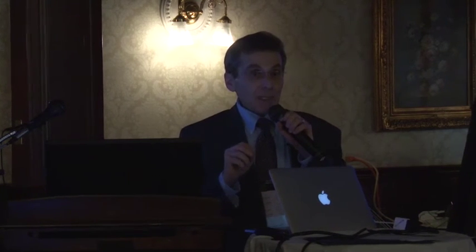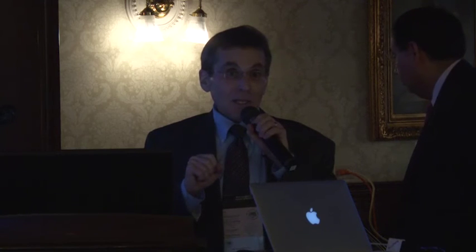Praveen Duggal has limited experience with spectral domain OCT angiography, but he's not been able to show regression of the lesion. And this is going to be a whole area of investigation once the drug becomes available. And I think you're going to need swept source OCT to really see it. I didn't get into the details of spectral domain versus swept source. Looking at these lesions, we're doing a study now. But with spectral domain, you can see them, but a lot of times they're not clear, no matter what platform you use. You know they're there, but with swept source, you can really see it. So I won't believe any of the data till we can look with swept source OCT angiography with the PDGF inhibitors.